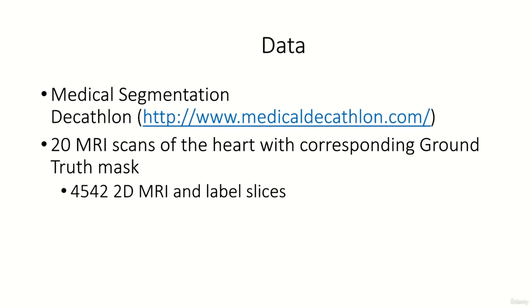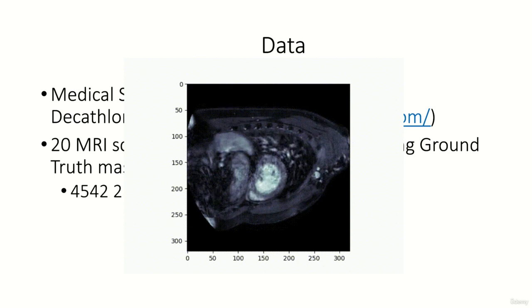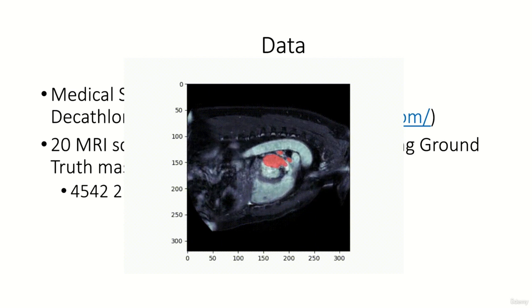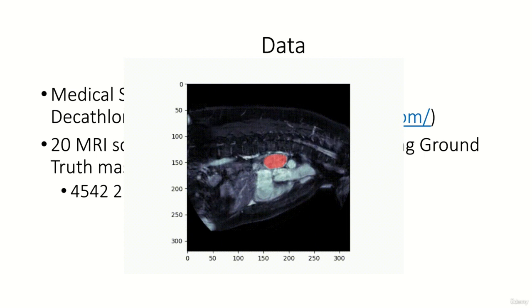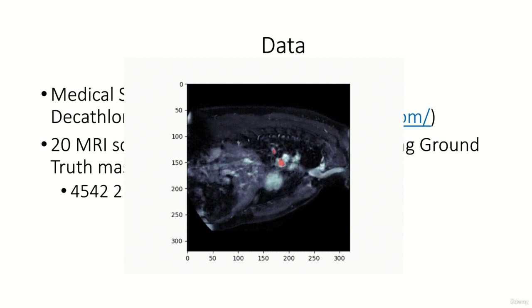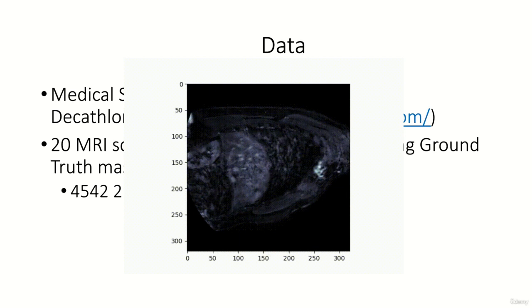Now it's time to take a look at an example. This video shows one example of the dataset. You can beautifully see how at first the left ventricle joins in, followed by the left atrium, which is visualized by the red segmentation mask. Can you imagine why it looks like the patient is lying on his stomach? Please take a second to think about this. It's the RAS orientation of the scan.